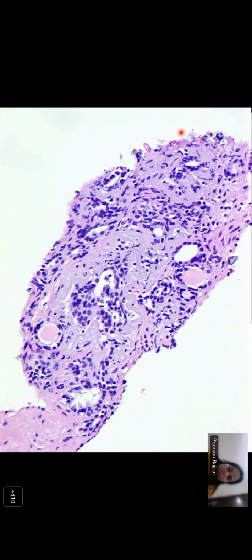No, sir. Do you see a little myxoid or an early desmoplastic kind of appearance of the stroma? Yes, sir. There is more, and kind of nuclear hyperchromasia. So hyperchromasia and prominent nucleoli will not go hand in hand in general. If the nuclei are hyperchromatic, then we hardly see the nucleoli. Fine. Verma sir, you want to prompt them?